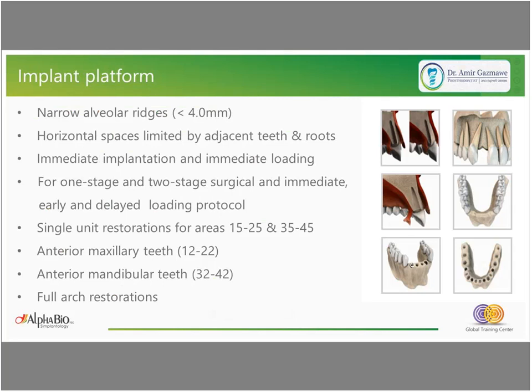So we can use this narrow implant platform and conical connection in the anterior area of the mandible. And of course, in the anterior area, when we have limited bone width, it can also be used in order to restore the missing area without the need for augmentation.